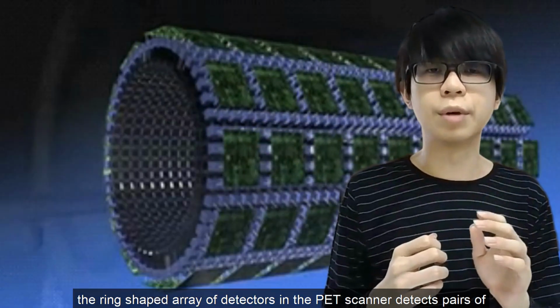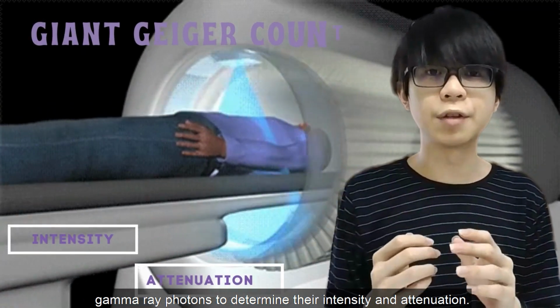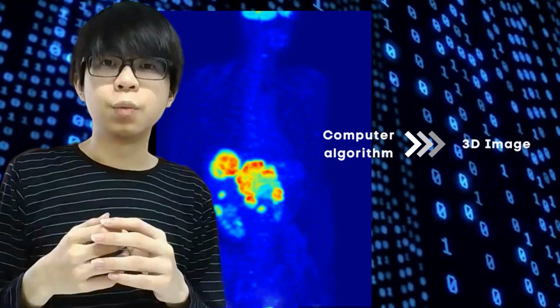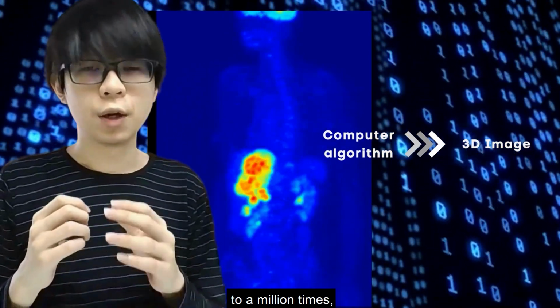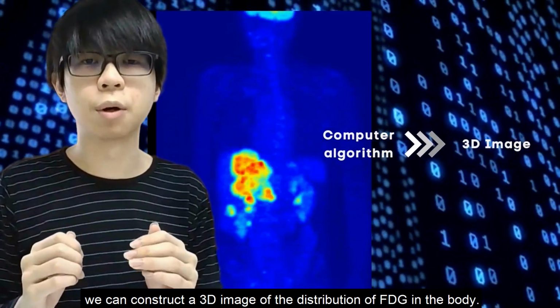The ring-shaped arrays of detectors in the PET scanner detects pairs of gamma-ray photons to determine their intensity and attenuation. With the help of a computer algorithm and repeated measurements up to 1,000,000 times, we can construct a 3D image of the distribution of FDG in the body.